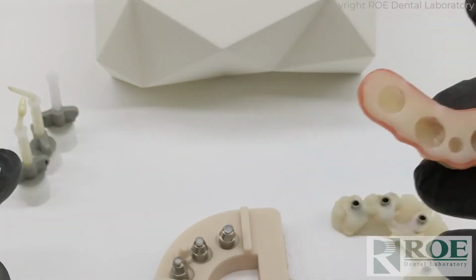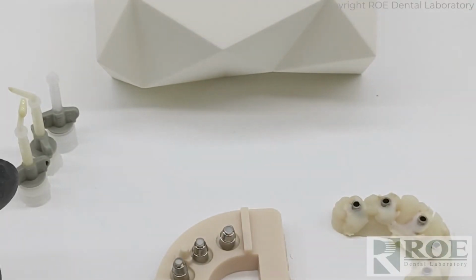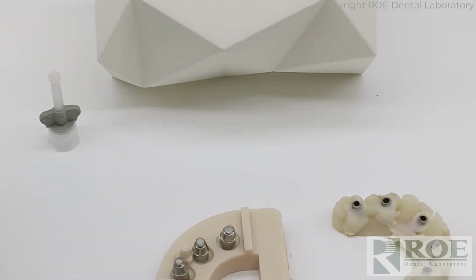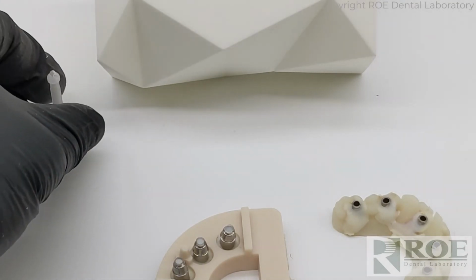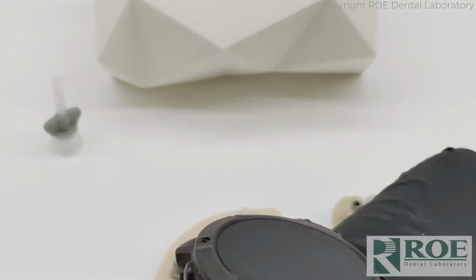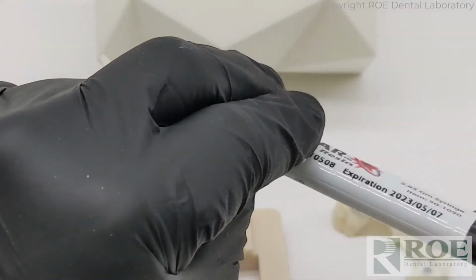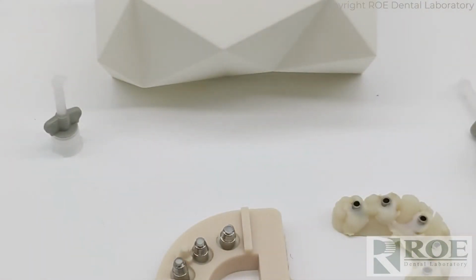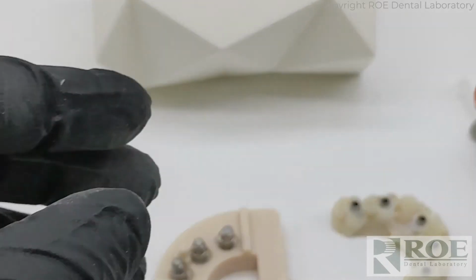And notice that there's some tips here. So Stellar comes with about 10 tips. Hold on to them. We've already used 2, and we're going to use a third now on the tube, and then who knows, you might use 4. So hold on to them, because you don't want to run out of tips.